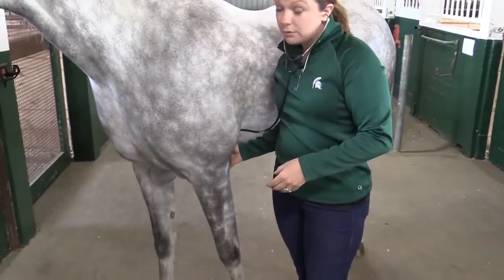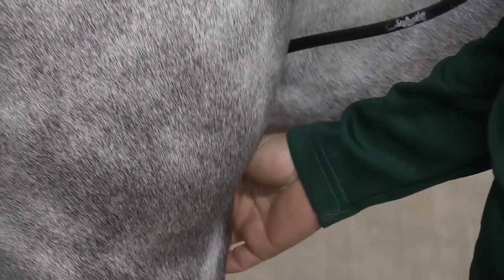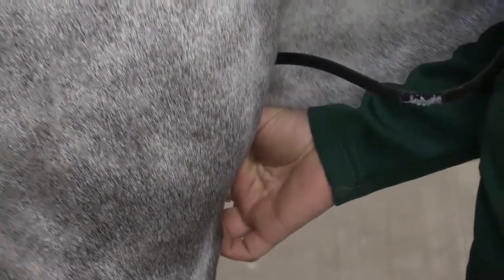What may surprise you if you've never listened to a horse's heart rate is it's actually a pretty faint noise — I thought it would be much louder myself. So you'll be quiet, listen, and you'll hear a very low lub-dub noise.